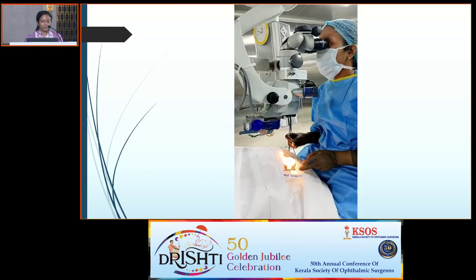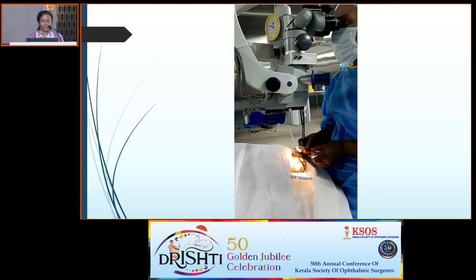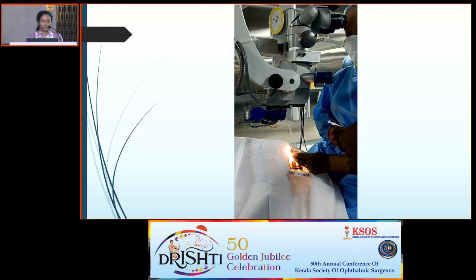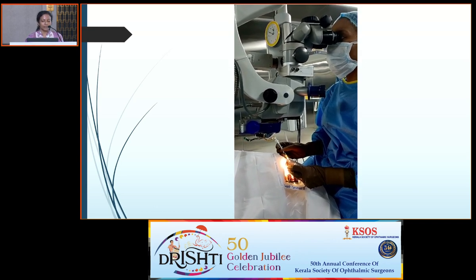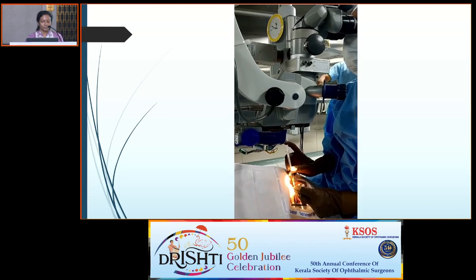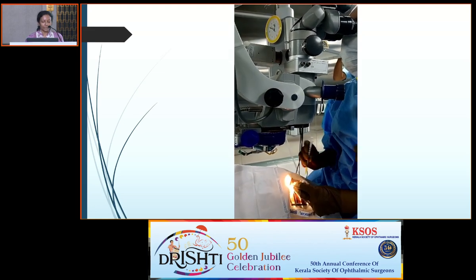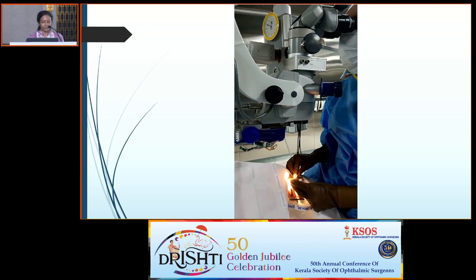The surgeon comes in. I anesthetize with a drop of paracaine. A caliper is taken in and the measurement is taken, which is normally 3.5 millimeter for pseudophakic and 4 millimeter for phakic patients. Sister hands over the needle. The injection is given with a steady push of the plunger. And then removed and handed over. And immediately I place a small cotton bud to reduce the vitreous reflux.